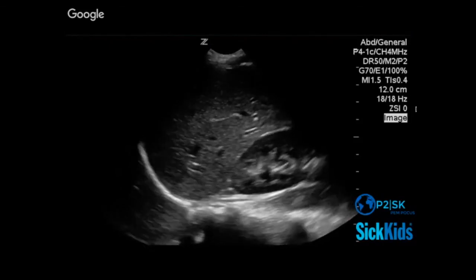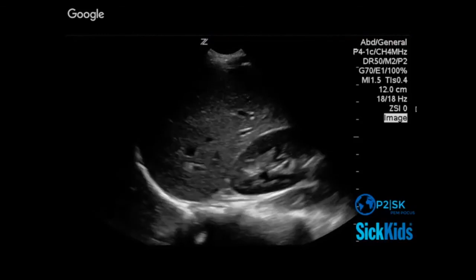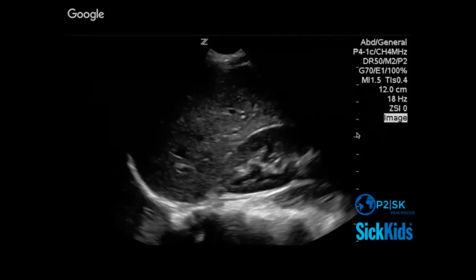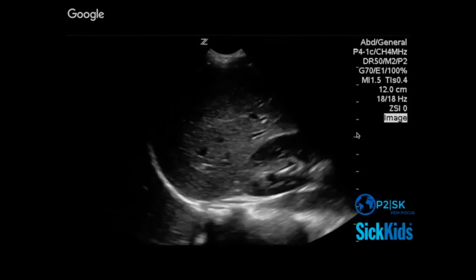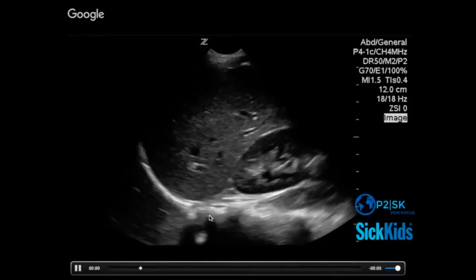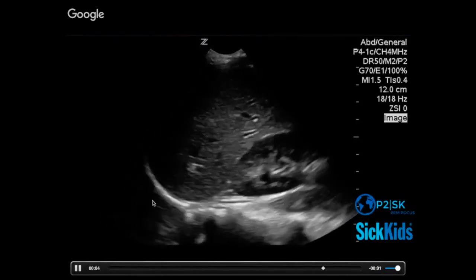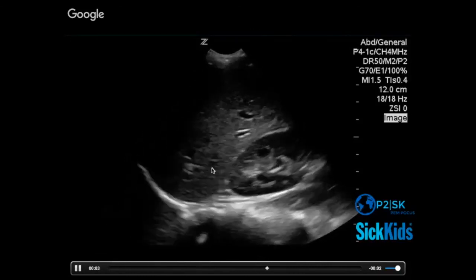Often in cardiac failure or other conditions, you may have a pleural effusion. So this is the right upper quadrant. So did anyone in this clip see a pleural effusion? No. What's this? Yeah, and it does not extend above the diaphragm. You just got mirror artifact here of the liver.